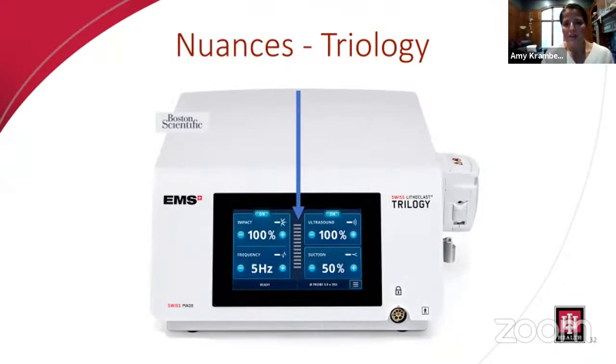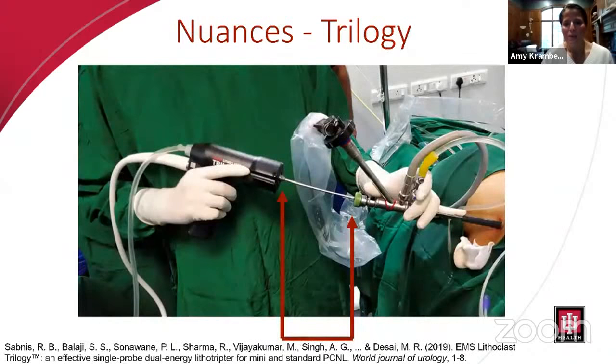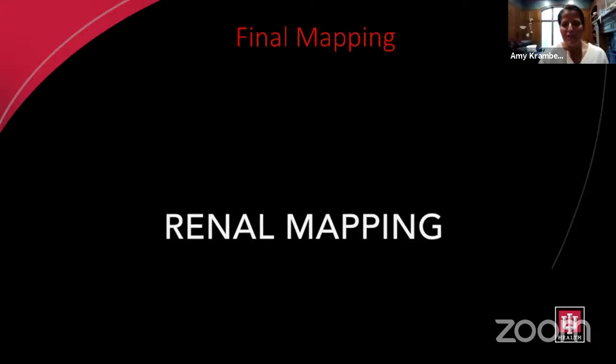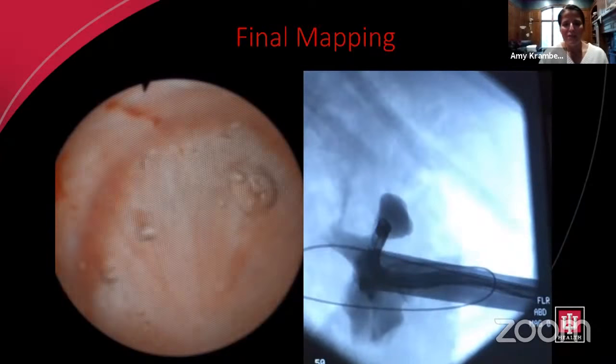What I also like about the Trilogy is it has a center line, which will tell you if you're bending the probe. And as I've said multiple times, the handpiece is heavy, so you can have a tendency to bend the probe, and the device will alert you if you're bending it too much and you're not as efficient as you should be. So after finishing the stone removal, I'll usually use a flexible nephroscope to do a final mapping.